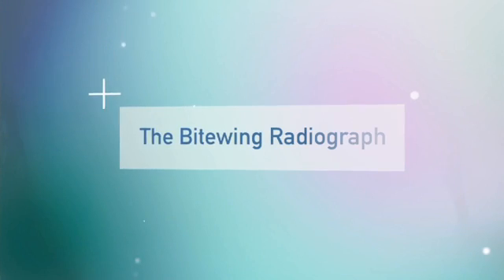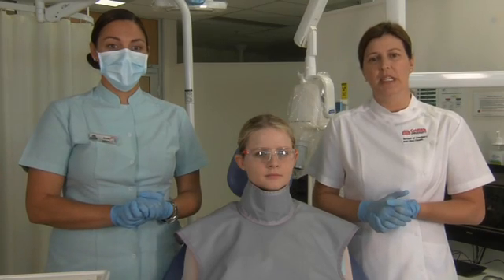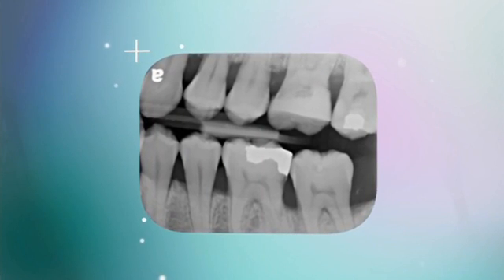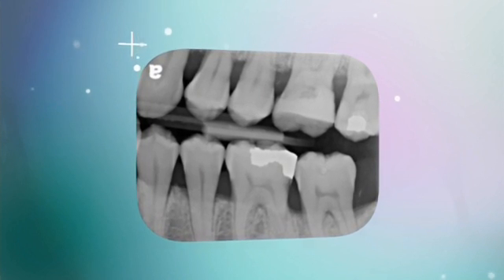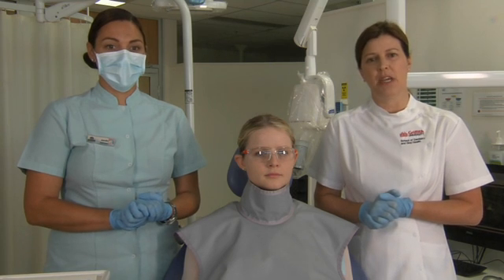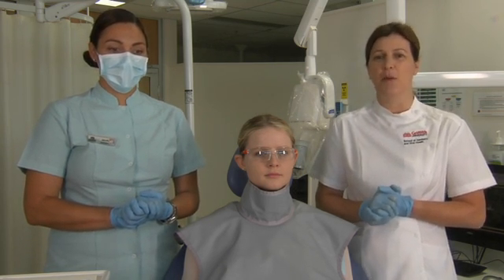The first x-ray we're going to take today is the bitewing radiograph. Bitewings are used to detect interproximal caries on the posterior teeth. One bitewing will expose the coronal aspects of the posterior teeth from the premolars to the molars in the upper and lower arch. As part of a routine examination, this would normally involve a left and right bitewing, but today we're going to demonstrate the left bitewing only.